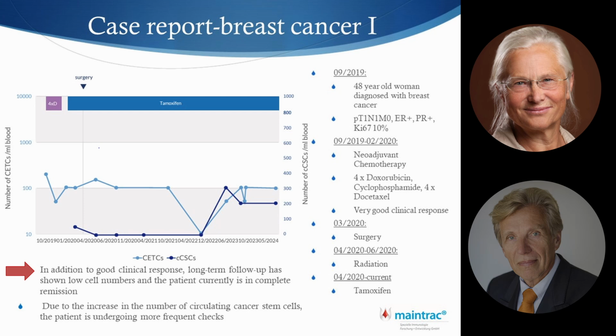So in addition to a good clinical response, long-term follow-up shows that cell numbers remain relatively constant with a dip in between, which we cannot explain at the moment.